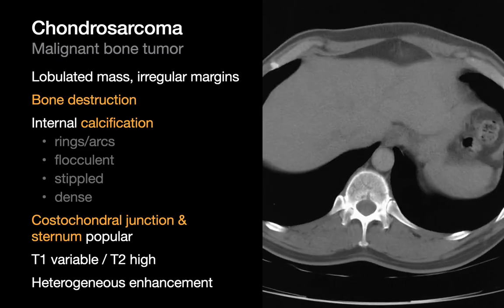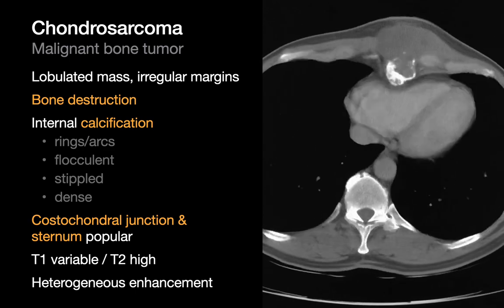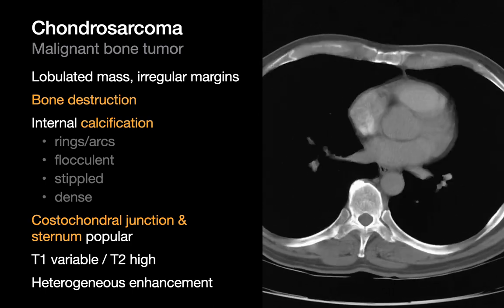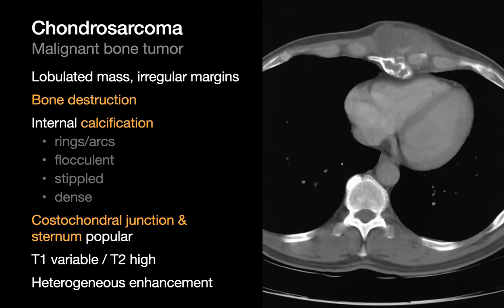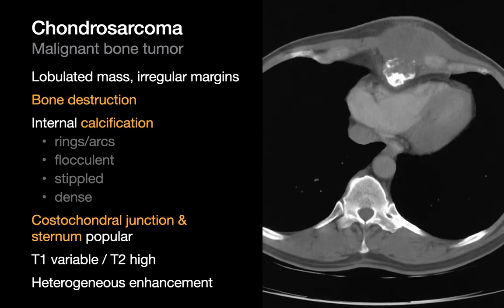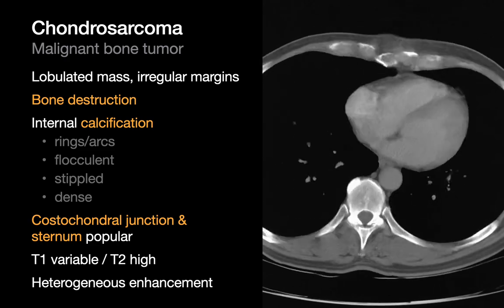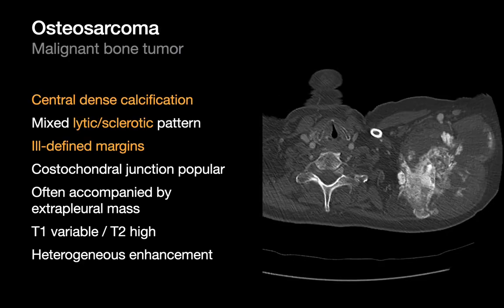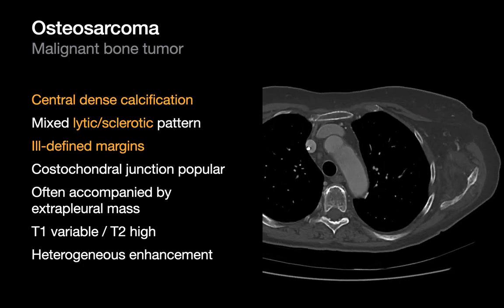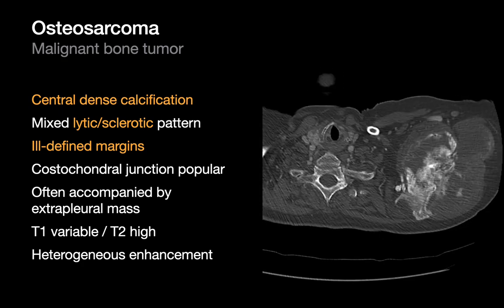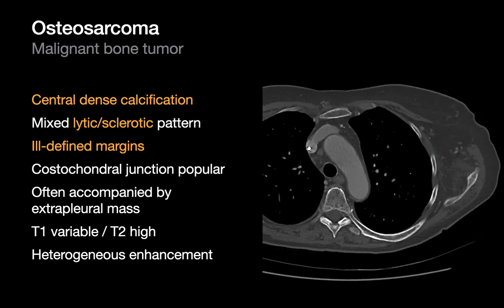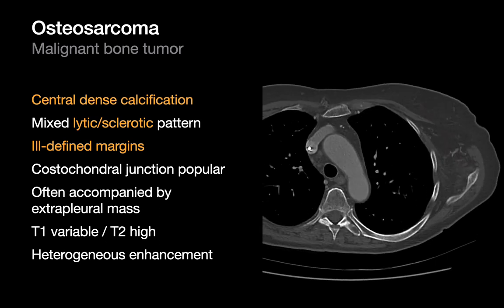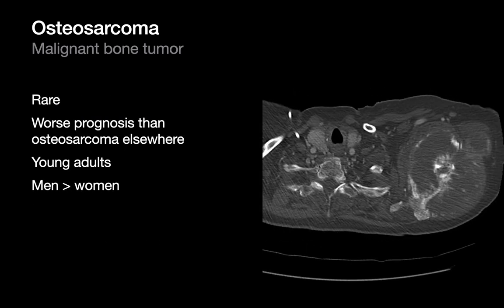Chondrosarcomas can resemble osteochondromas and chondromas on chest x-ray. The sternum and costochondral junctions are common sites. Tip-offs for chondrosarcomas in the chest wall include aggressive bone destruction and cartilaginous matrices with calcifications that might appear flocculent, stippled, or as rings and arcs. Osteosarcomas are the other aggressive uncommon bone tumor of the chest wall, featuring bone destruction, aggressive periosteal reaction, and dense central calcification or ossification. The prognosis of osteosarcoma when it occurs in the chest wall is particularly poor.